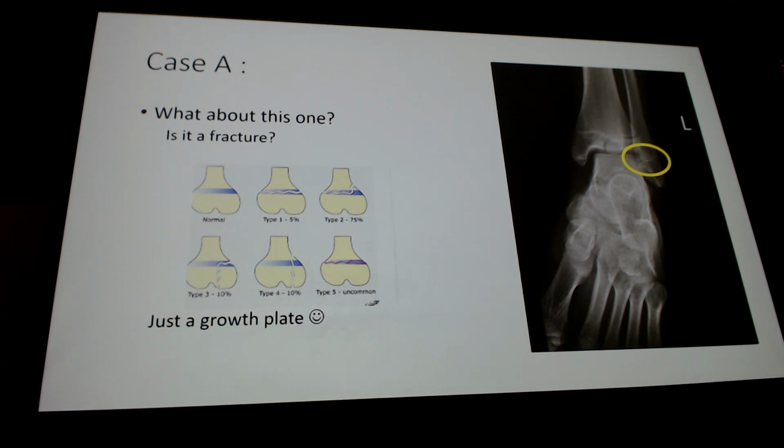I don't, per se, but also, where were they tender? Anteromedial. This would hurt significantly if they had a fracture in there as well. So use that pain, right? When you're like, I'm not sure. In real life, you'll have other pictures too, right? But then also use your physical exam to help you figure out if that might be a fracture or not.